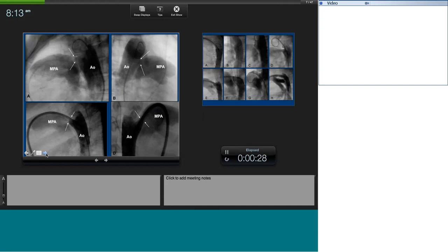Angiograms are obtained in two views. On the left, the lateral view defines the ampulla and shows the narrowest end of the duct. On the right, the RAO view is essential in many circumstances — especially when there is an overlap between the ampulla and the aorta. When the ampulla is not well defined in one view, you may see it clearly in the other.